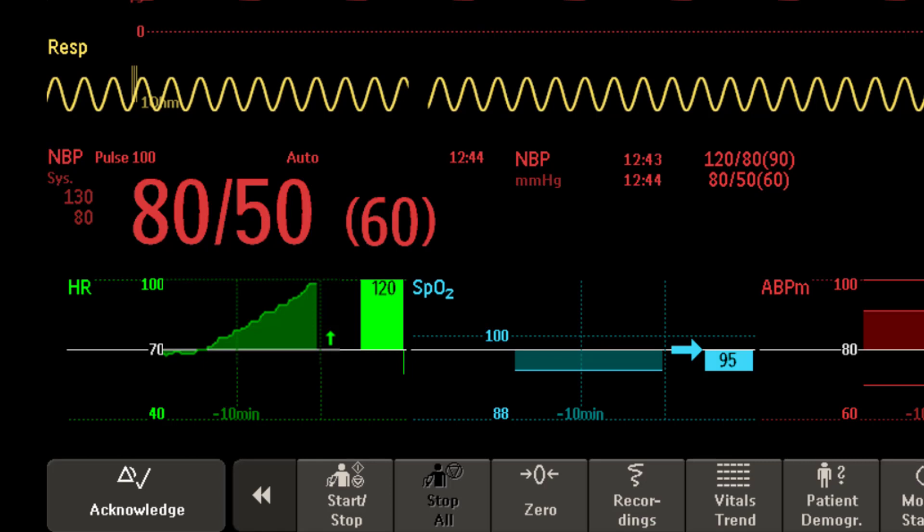The deviation bar shows how the currently measured value deviates from the horizon. The horizon is the reference value to which deviations in the measurement are compared.